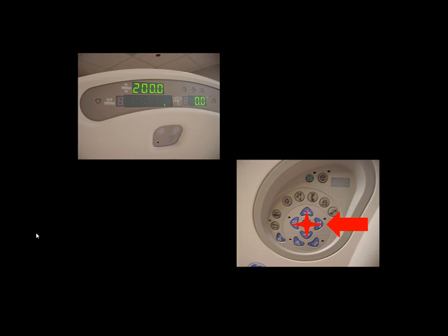These buttons move the table. When you press just the outside buttons, it moves slowly. If you press the outside button in conjunction with the inside button, the table moves faster. And these two buttons are to angle the table.